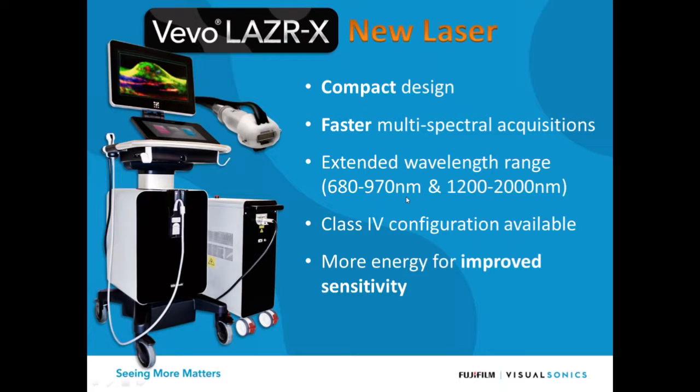And it has an extended wavelength range. You can't see very clearly from the photo, but there are actually two separate ports here into which the optical fiber can be plugged, and I'll talk about the fibers in a second. And we have the standard range of 680 to 970 nanometers, which we have on our current Vevo Laser product. And we have an additional range now available, the 1200 to 2000 nanometer range as well.